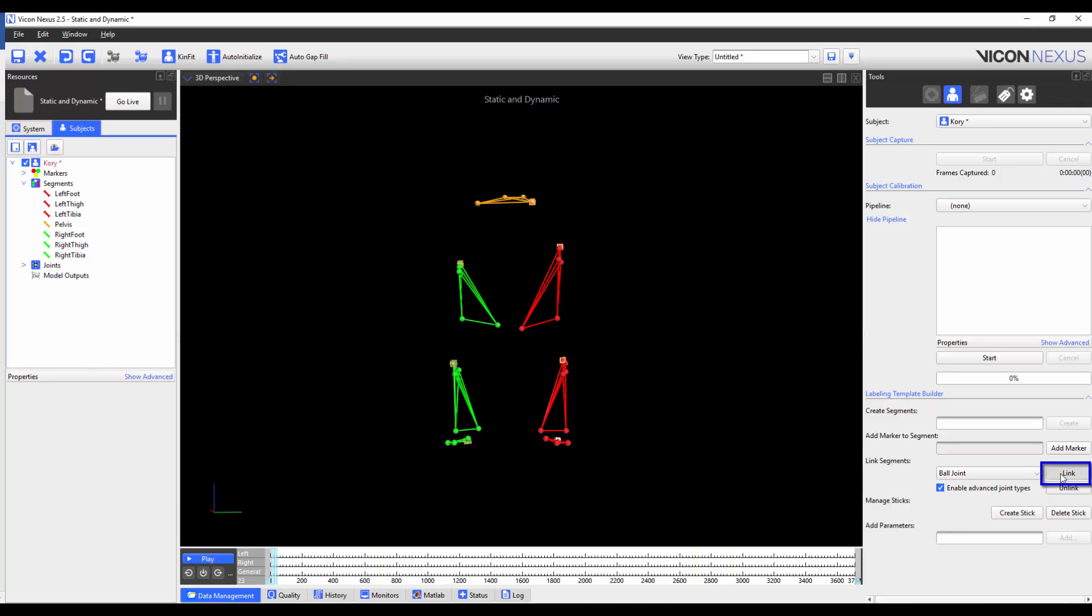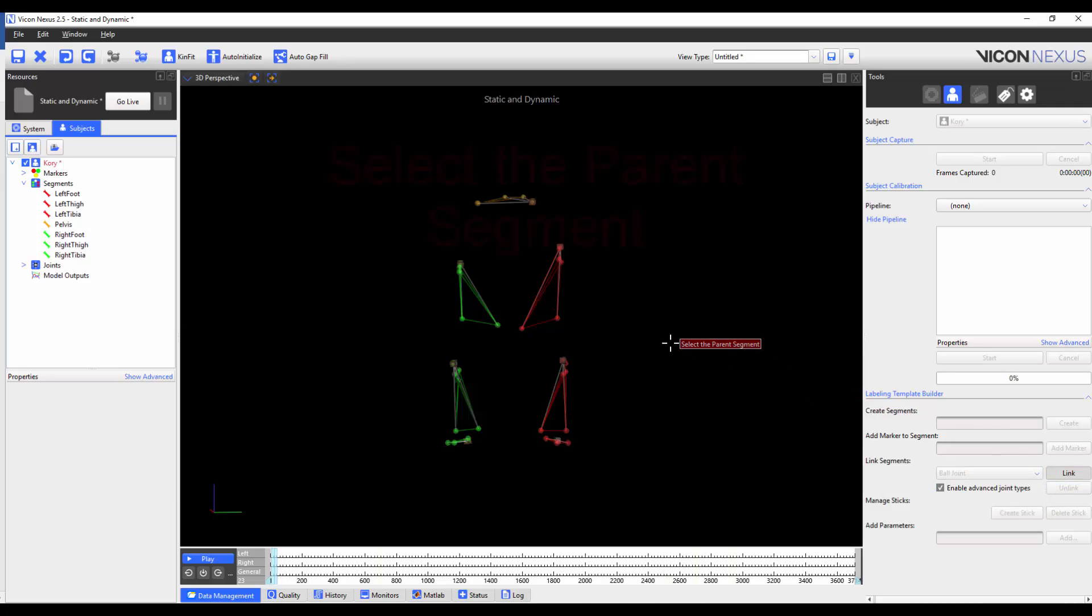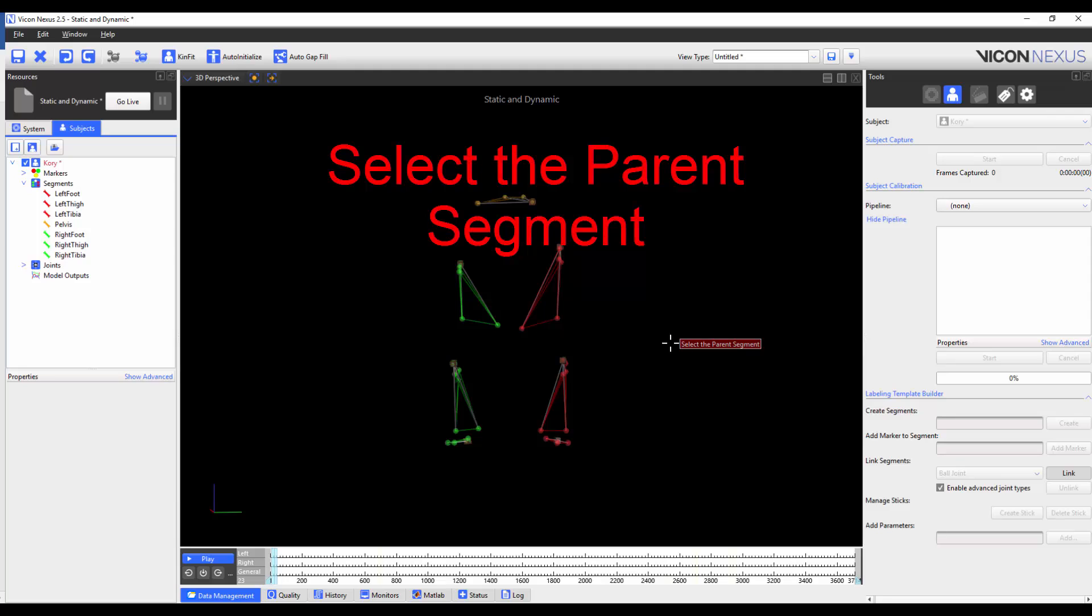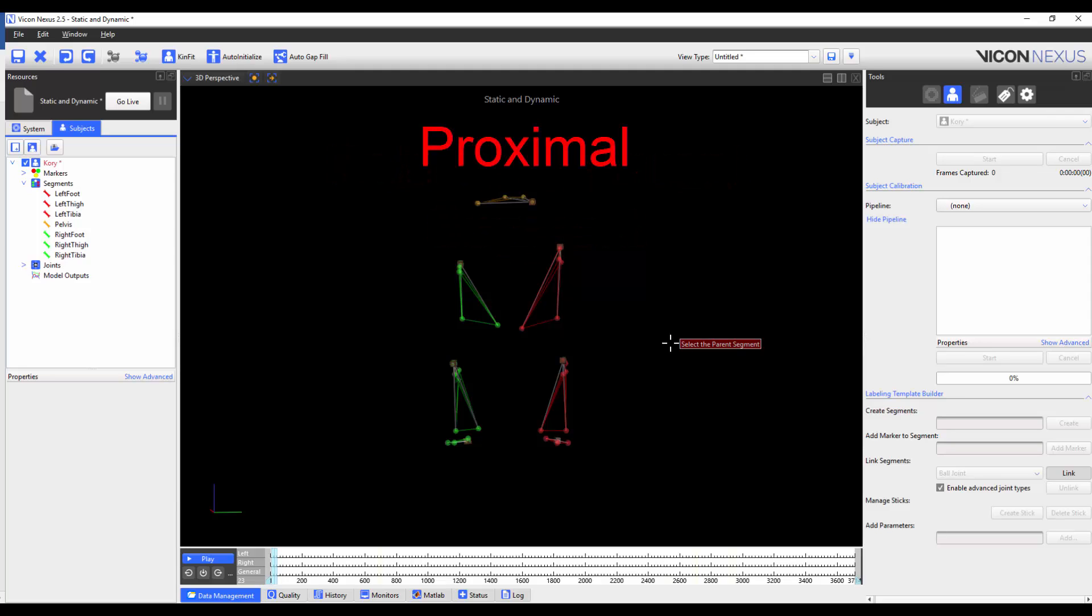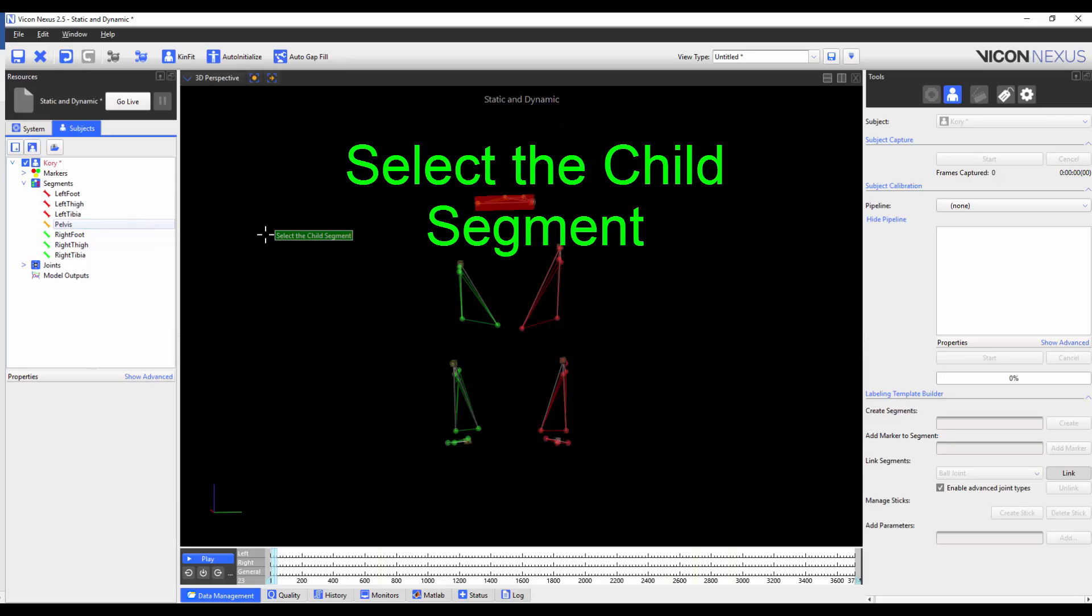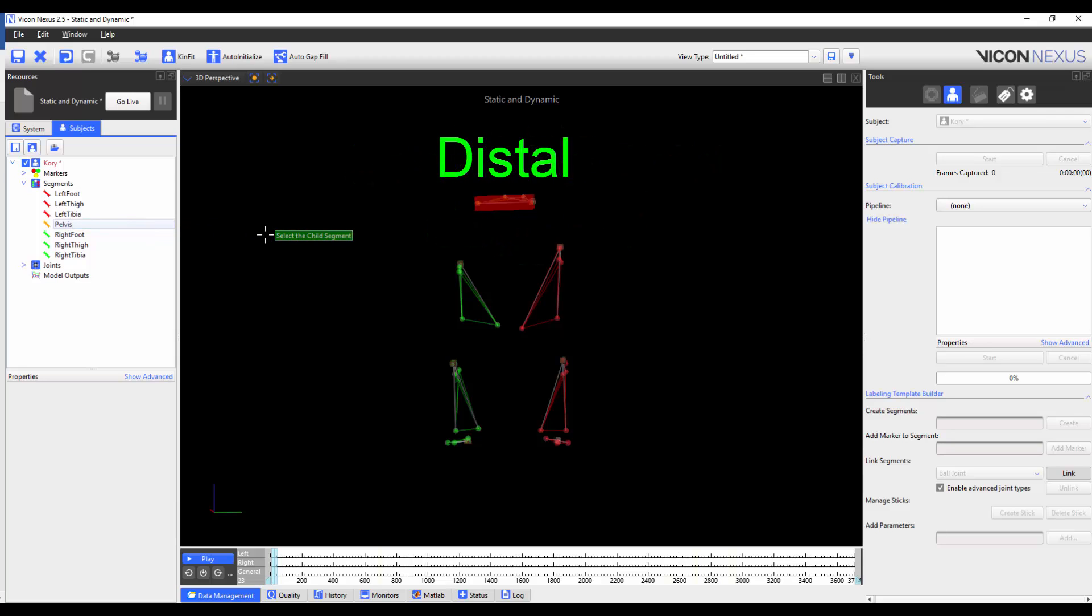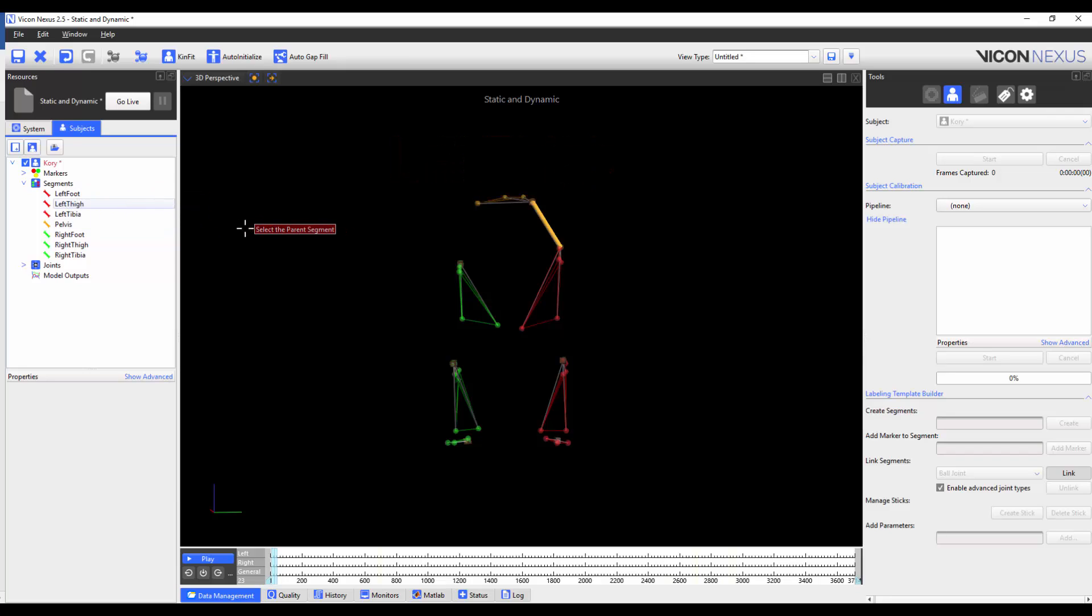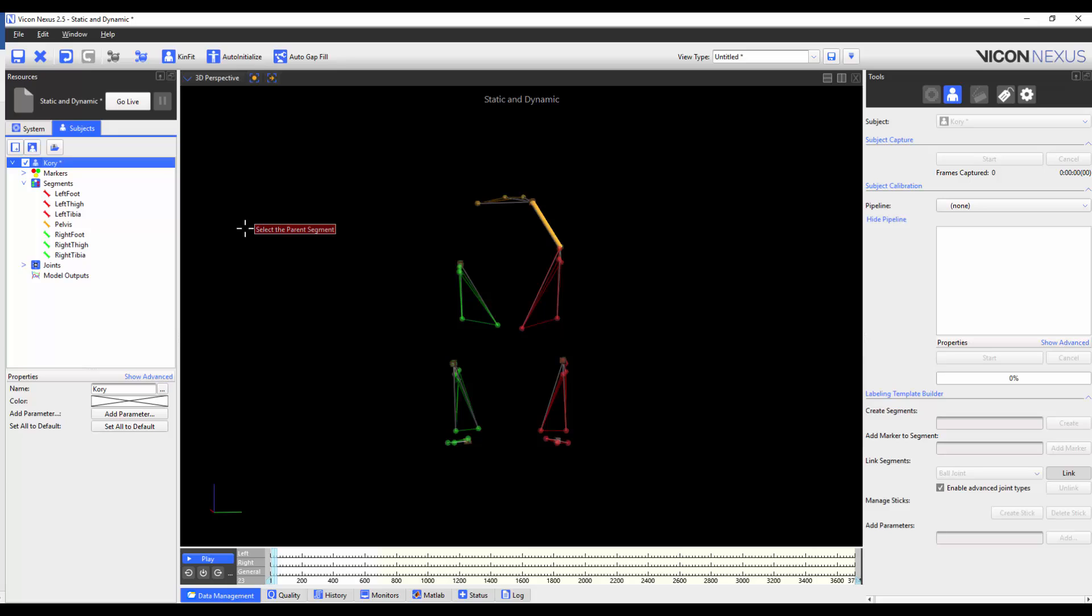When I click on link, it will prompt me to choose the parent segment, which will be a proximal segment, in this case the pelvis. It will then prompt me to pick the child segment, which will be the distal segment, in this case the left thigh. I'm going to repeat the process until all segments are linked.